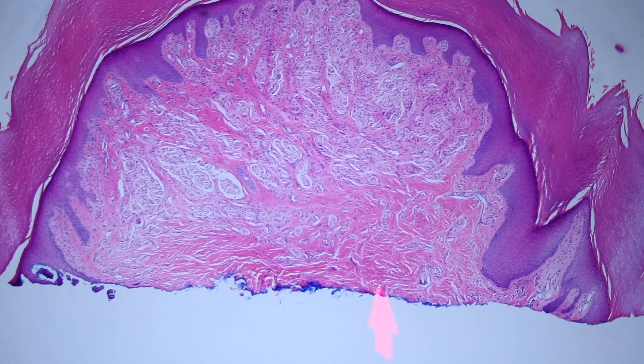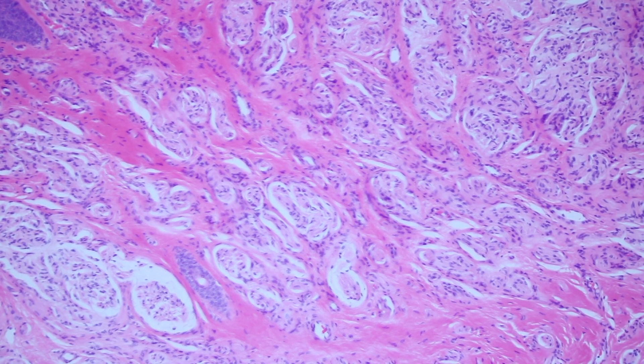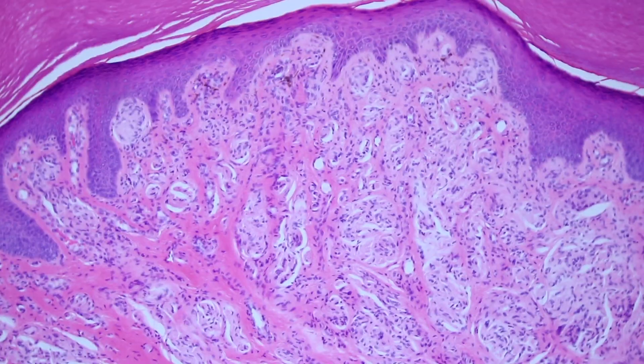Let's look at the other piece. You can see much more clearly — the collagen here is really dense, kind of almost scar-like. And then you've just got a big tangled bundle of all these nerves. Way too many nerves for normal skin. You normally have just occasional nerves scattered around, not these big bundles of multiple nerves tangled together.